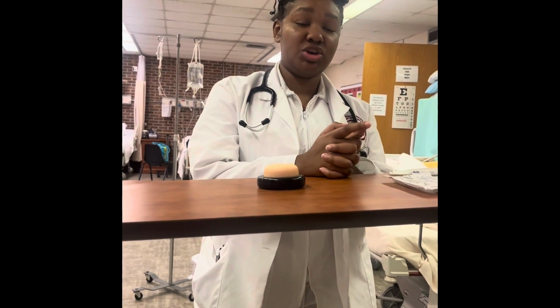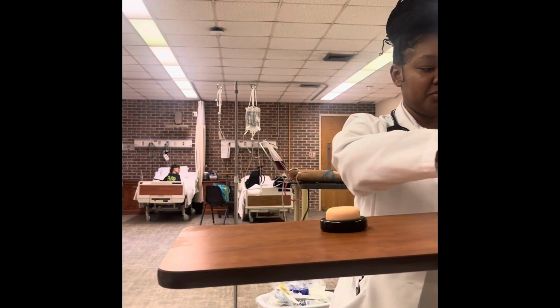Before I get started, I'm gonna check your MAR. This should be my third check. I'm gonna just check your orders, the medications you should be getting, and your dose. I'm gonna be giving you an IM medication and a subcutaneous medication today. So your MAR stuff looks good. I got everything down. So I want to perform hand hygiene and put on some clean gloves.